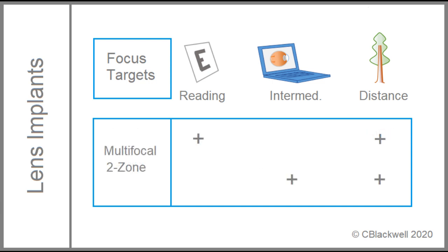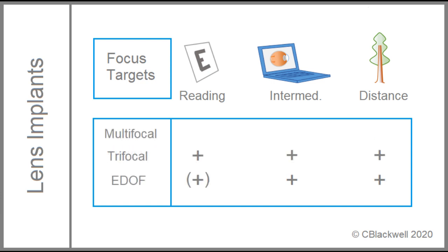Moving on to multifocal lenses. Early versions had two focal distances, but with a difference. One version had its foci set at far and near. The other version had far and intermediate. Each had a limitation, a missing distance, so it became an option to mix them using one lens of each type. The current generation of multifocal lenses aim to improve functionality at all three distances.